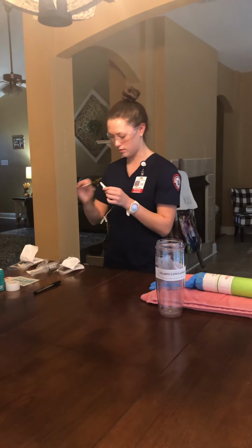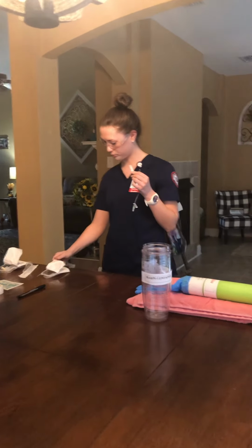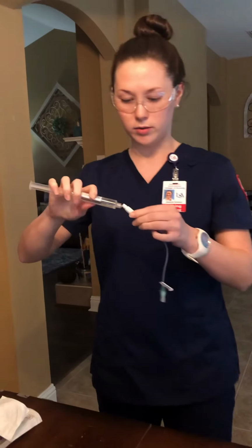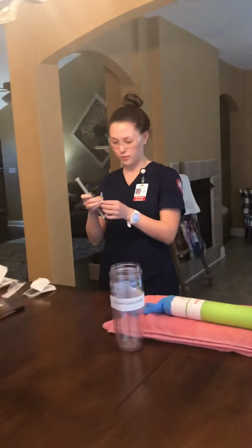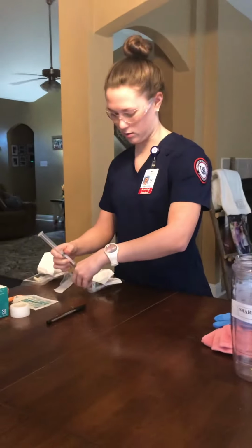So once that is done, I'm going to want to prime the tubing. I'm going to make sure that it comes out. Okay. And then I'm going to connect this, and to prime, make sure that we see it coming through the tube. And there it goes, it took a little bit. Okay, so now that it's primed, I'm going to loosen the cap and place it in the sterile container.